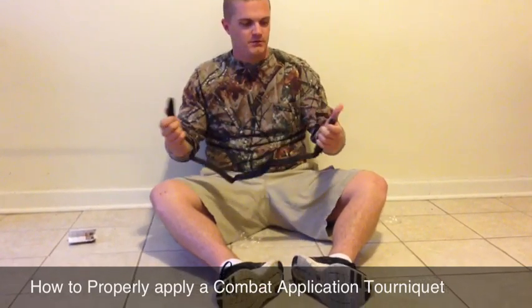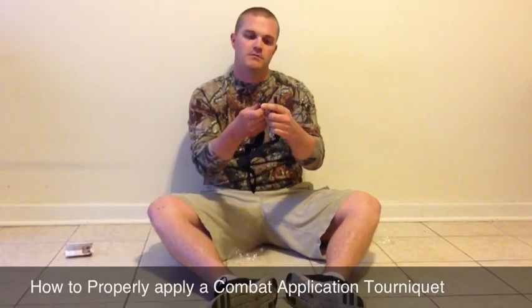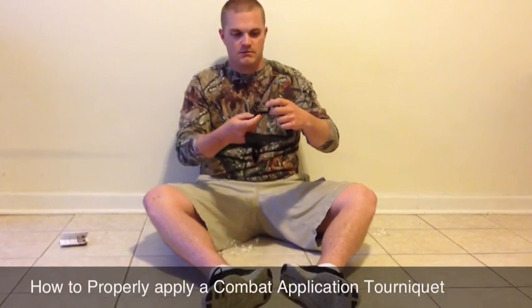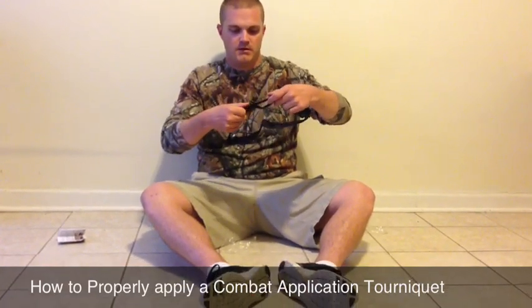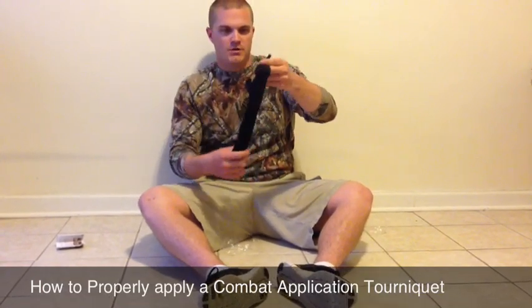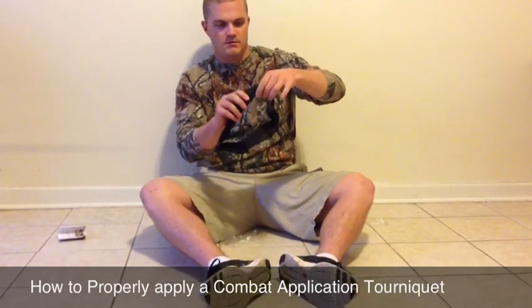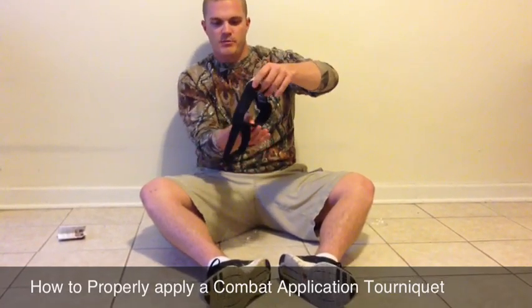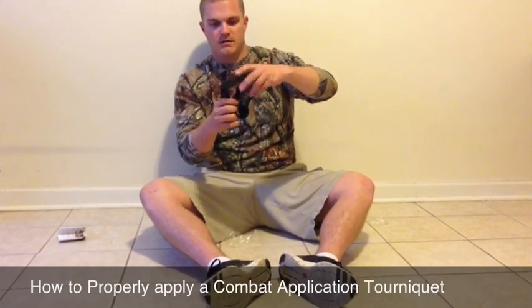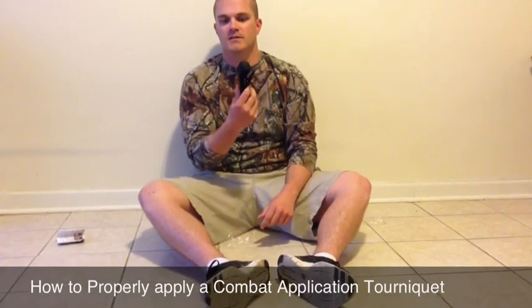Now if you're going to be using this on an arm, you only need to go through the first little buckle here, like this. Pull it through about 6 inches, and then seal it back on itself. Let it hang in the middle, then pull up from the middle, and stick it on itself again. You can put this in your pocket or somewhere easily accessible.